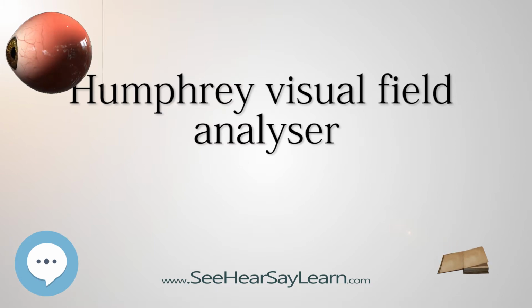Global indices. These provide a statistical summary of the field with one number. Although not used for initial diagnosis, they are essential for monitoring glaucoma progression. They include mean deviation, MD, derived from the total deviation, and represents the overall mean departure from the age-corrected norm. A negative value indicates field loss, while a positive value indicates that the field is above average. A p-value is provided if the global indices are abnormal. It provides a statistical representation of the population. For example, P2% means that less than 2% of the population have vision loss worse than measured.